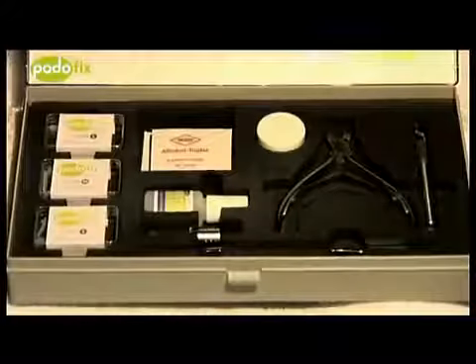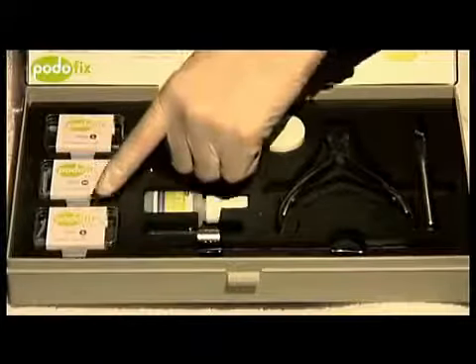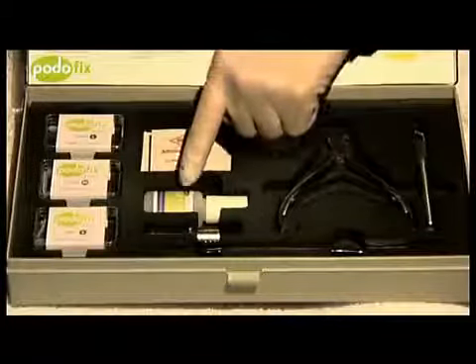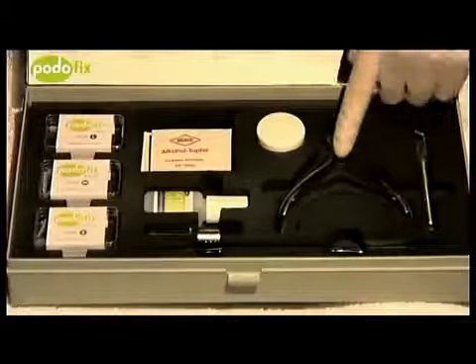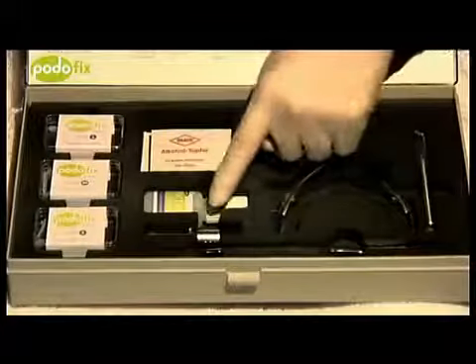The complete set includes all the products and instruments that you will need to use the Podofix brace: braces in three different sizes, alcohol swabs, the adhesive, the bracing instrument, the side cutter, and the Pedigel with a spatula and a microlamp.